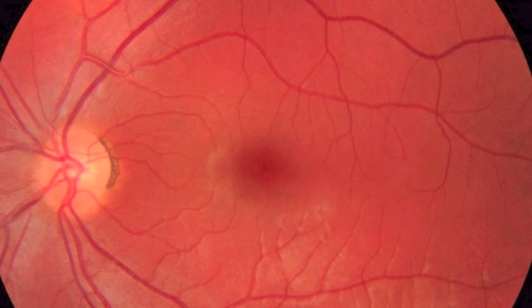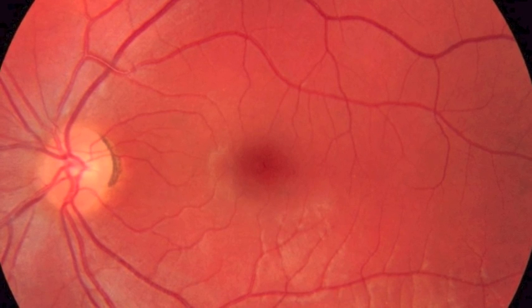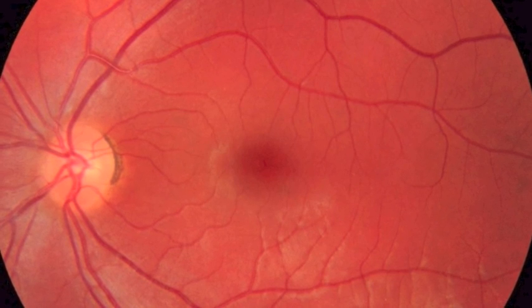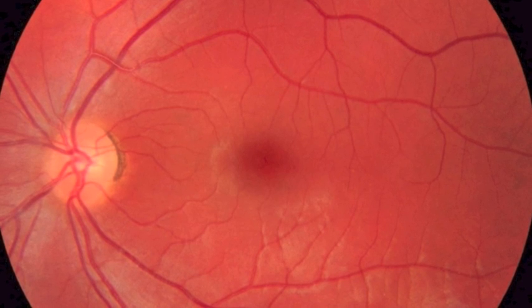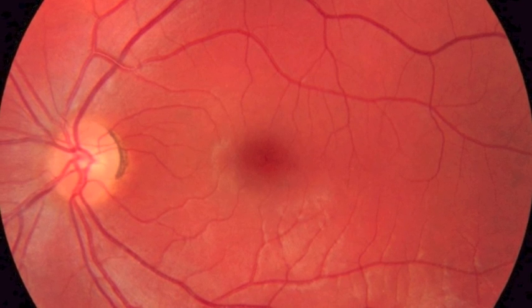Because the process is binocular, we see a 3D stereoscopic image. This allows us to see depth in things like the cup. Indirect ophthalmoscopy is much better to use on patients with media opacities compared to direct ophthalmoscopy, and because of the longer working distance, it can be much more appropriate for some patients, for example, children.